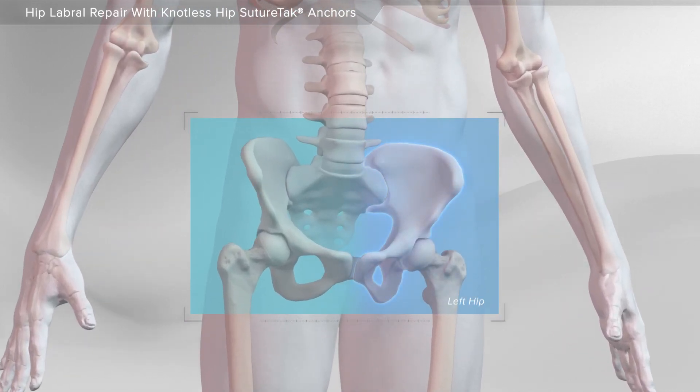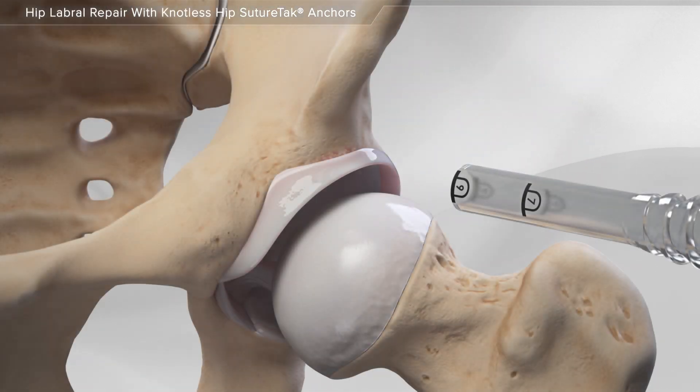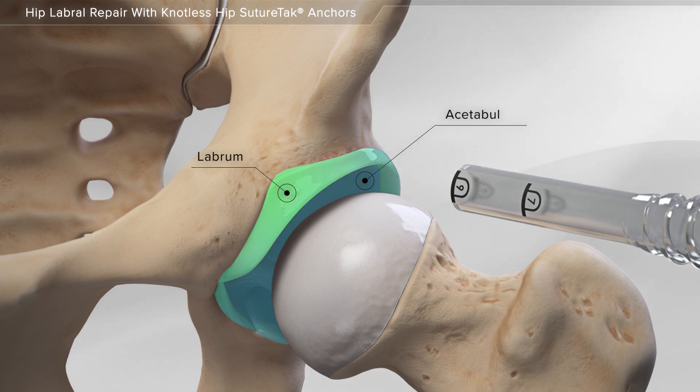In this animation, we will show the repair of a damaged labrum in the hip using a knotless suture tack anchor. The labrum in the hip surrounds the hip socket, or acetabulum, and helps stabilize the hip joint. It may be damaged over time or due to injury and cause a sudden onset of pain.